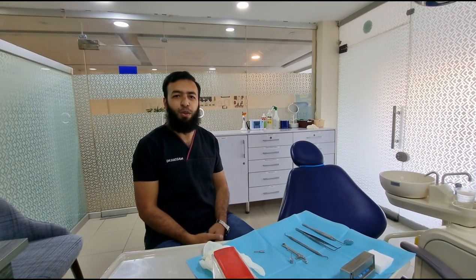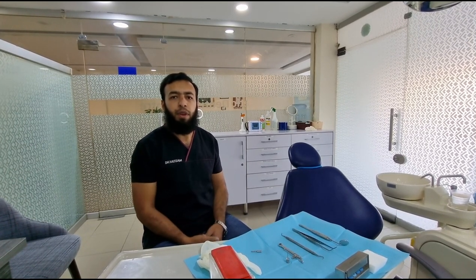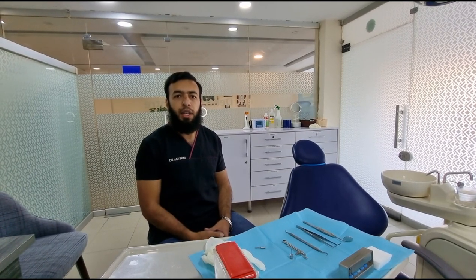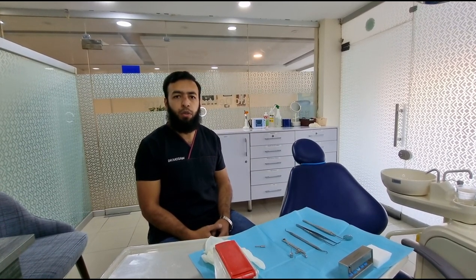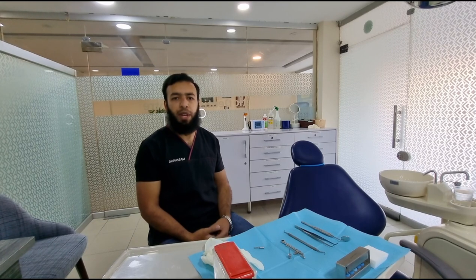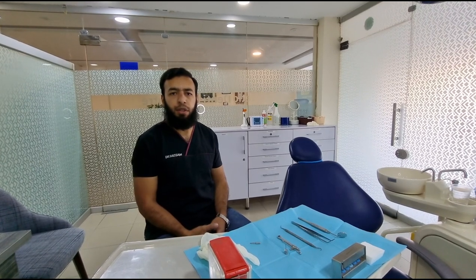In this video I am going to talk about how you gain access to the dental implant in the second stage surgery, after three to four months of healing has passed and you have determined on radiograph that the implant seems to be osseointegrated. Now is the stage when you gain access to the implant by removing the soft tissue over the implant and place a healing abutment or gingival former, so that you get a good contour of soft tissue which will mimic the natural tooth when the crown is placed.